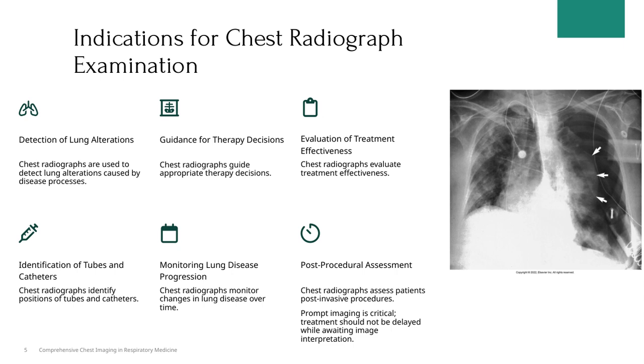Recognizing these changes early can significantly impact patient outcomes. So overall, chest radiographs are a versatile tool, integral to post-procedural assessment, ongoing monitoring, device placement, evaluating treatment effectiveness, guiding therapy, and detecting disease-related lung changes.